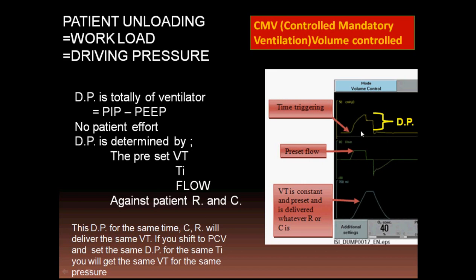And here, this is the driving pressure. This is what we call driving pressure. We're going to talk about it separately. This is the pressure between the PEEP, the zero point, and the peak inspiratory pressure. This is the pressure which is responsible for the delivery of the preset tidal volume. This is very important.